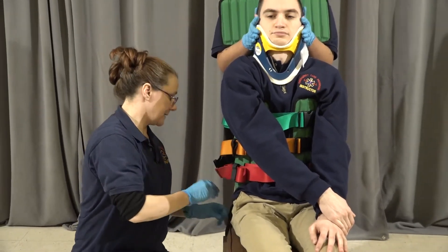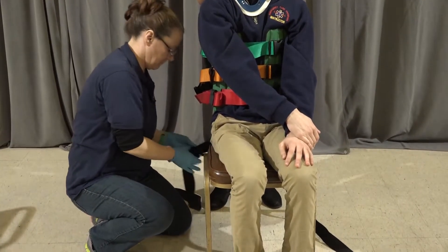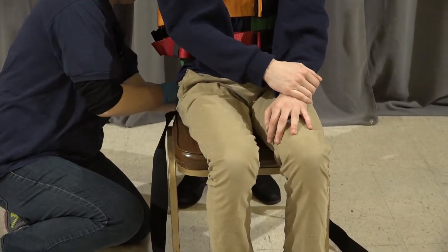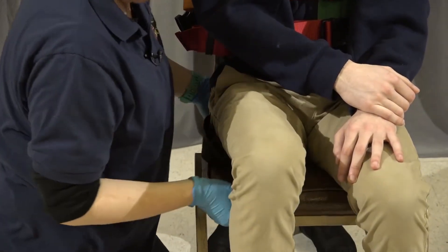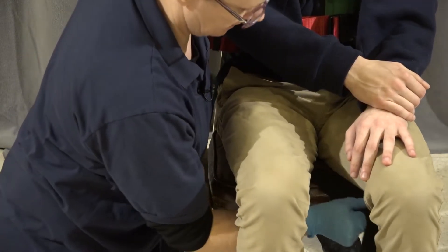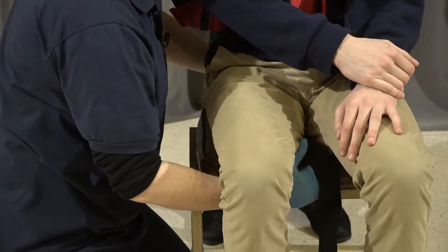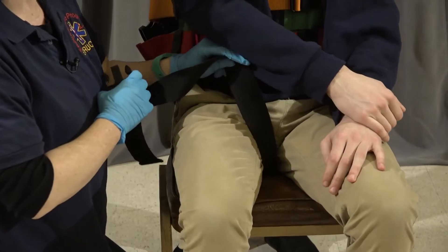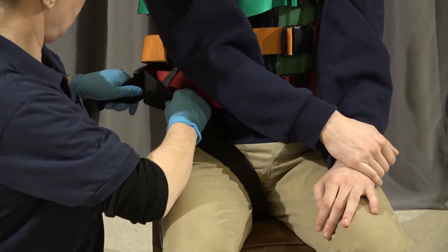We're going to move on to secure the legs. Make sure the strap is under the buttocks and comes up through the legs — right to right and left to left. If it's a gentleman, make sure we can ask him to adjust. Then we're going to feed and pull.